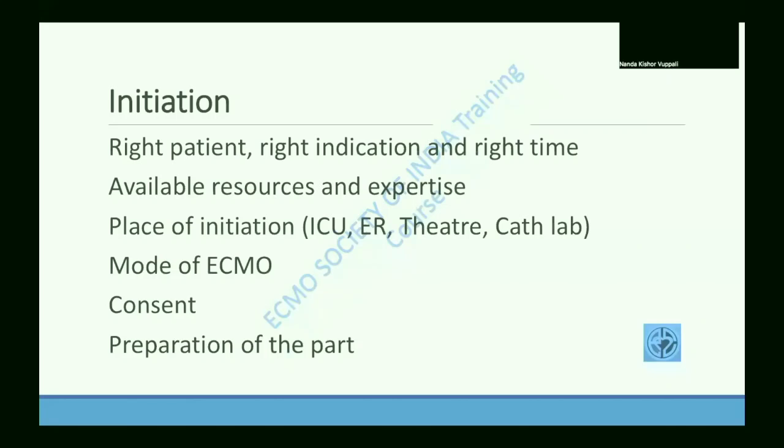Let's start with initiation. The initiation process starts right from when you get the call for ECMO. A lot of the success of ECMO depends on choosing the right patient for the right indication and initiating it at the right time. And look at what resources and expertise are available. Do you have all the people or do you need any other help? And where are you going to initiate? Are you going to initiate ECMO in the ICU, emergency room, theater, or cath lab? A lot of it depends on how sick the patient is and what other co-interventions the patient would need.